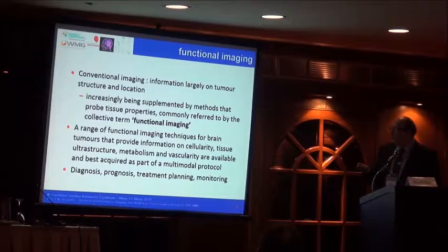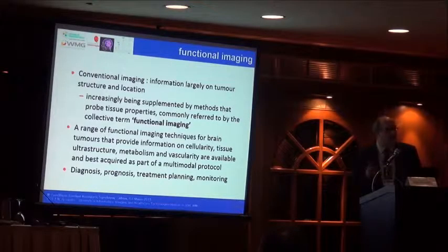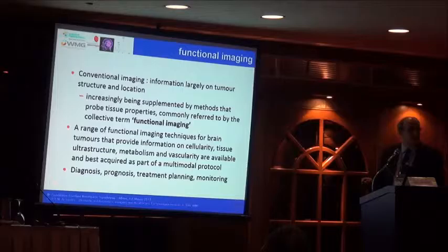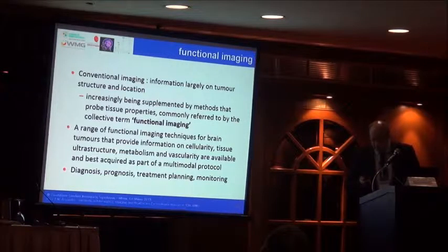So we call these techniques functional imaging techniques, although they're not fMRI techniques, and I'll talk to you about this in a minute. And they help us a lot. We have evidence, and I'll show you the evidence in terms of texture analysis, that helps us a lot in the diagnosis, prognosis, treatment planning, and monitoring of the disease, especially in children.